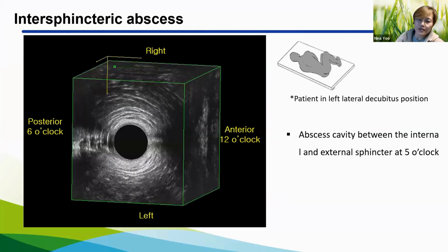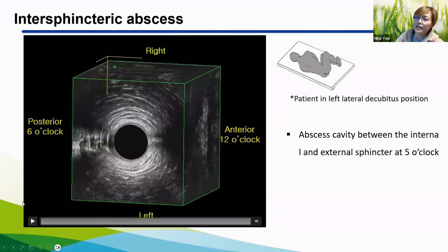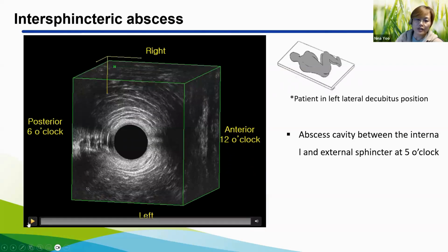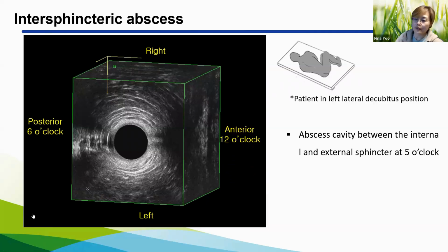Maybe 60. You can actually get the understanding. You just need to know the anatomy of the anal canal, and if you have a full grasp of the anatomy, you can learn it really quick. You don't have to worry. The longer you look at it, the more cases you encounter, you will get it right away.